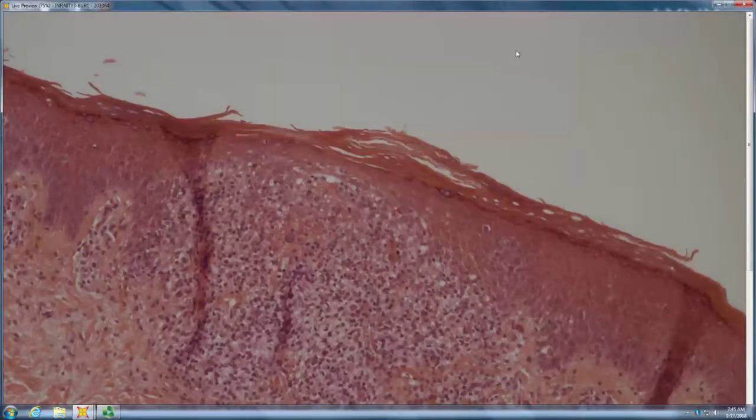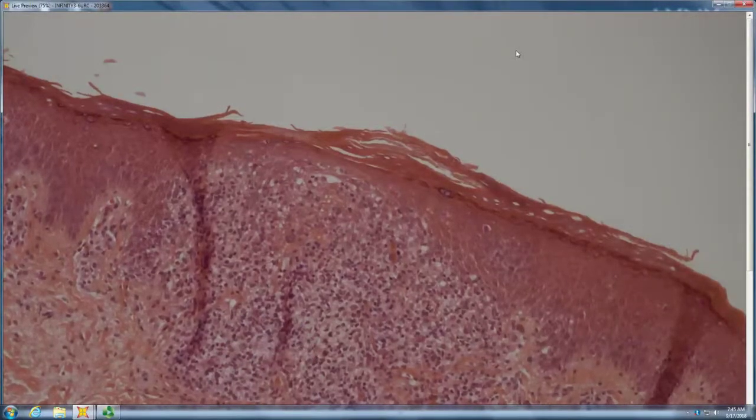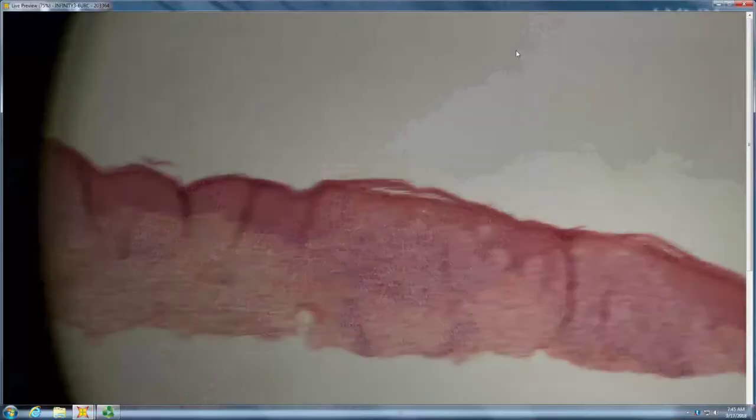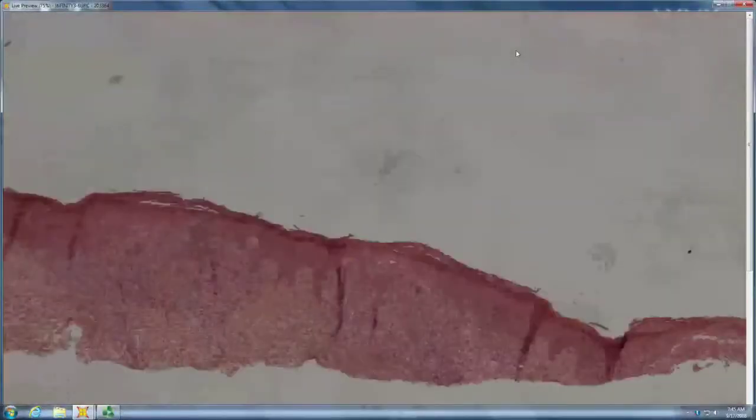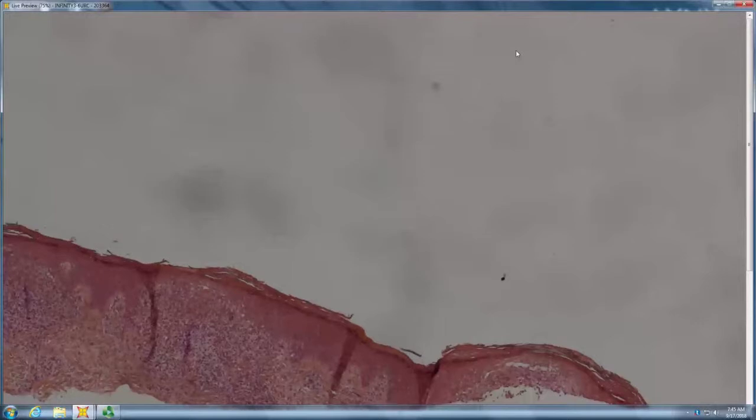And what kind of cells are in here? A lot of histiocytes, maybe. Lots of histiocytes. Do you normally get histiocytes in something that's LP? No. So when you see something interface with, first off, what looks like lymphs with too much cytoplasm, what do you have to think of?